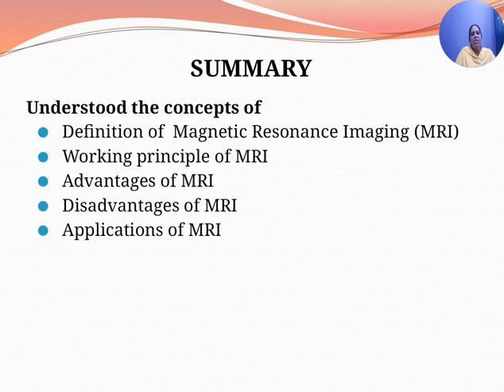Then the applications of MRI. MRI is used in several areas. Soft tissues can be discriminated easily. It is used in the study of proton imaging of internal human anatomy, both invasive and non-invasive. Measurement of blood flow in proton MRI imaging, and it is used in observing the functioning of the heart, that is the myocardium, and to assess the irregularities in heart diseases, infarctions, and monitor the response to therapy. And water and lipids can be discriminated easily using MRI.